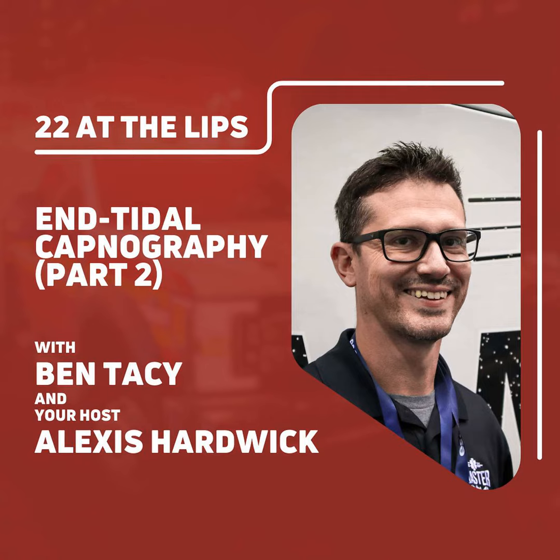The way that capnography works is I try to create this visual that your alveoli is a boat dock. The blood cells are passing by that boat dock, and you are the oxygen molecule. You walk out to the boat dock, you wait for the boat to come up. The passengers currently on the boat dock are those products of waste, CO2. You and the CO2 kind of high five each other as you pass by. You get on the boat, they get off, and then they leave, crossing the alveolar membrane, going up through our bronchioles, out through our bronchi, and we exhale them.